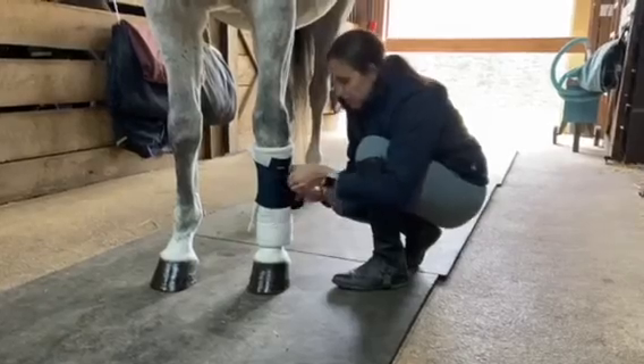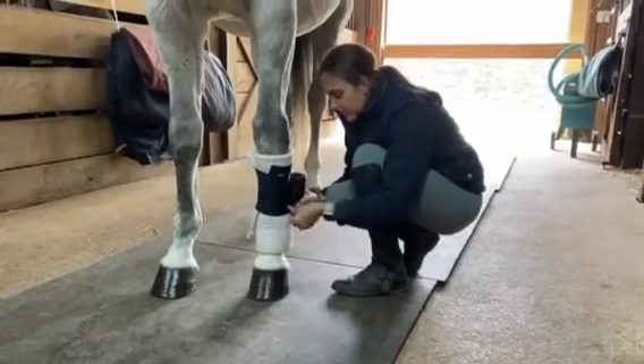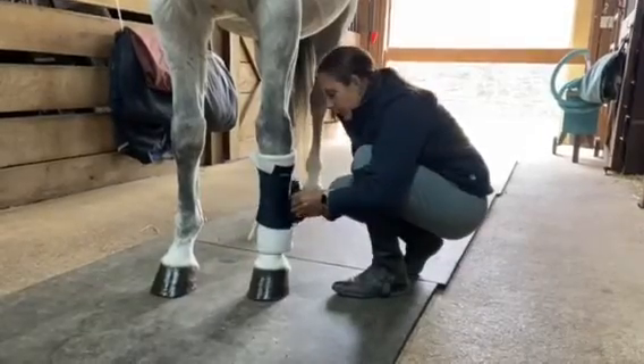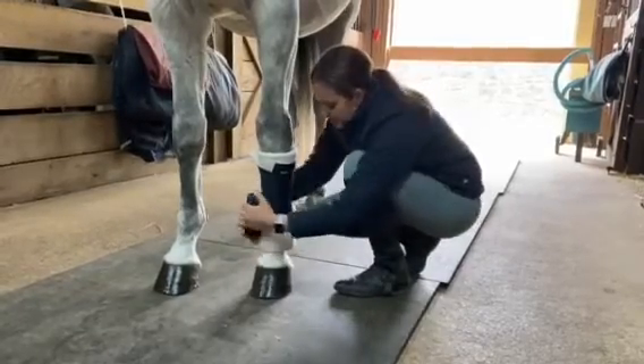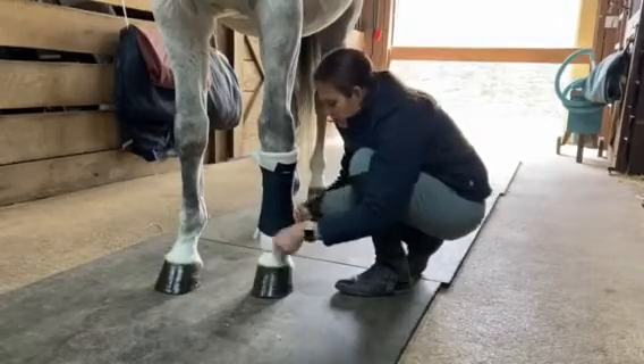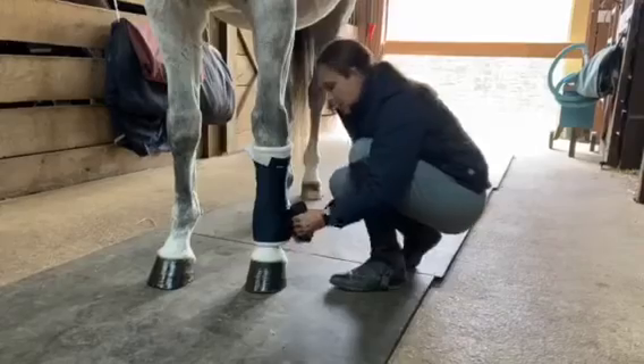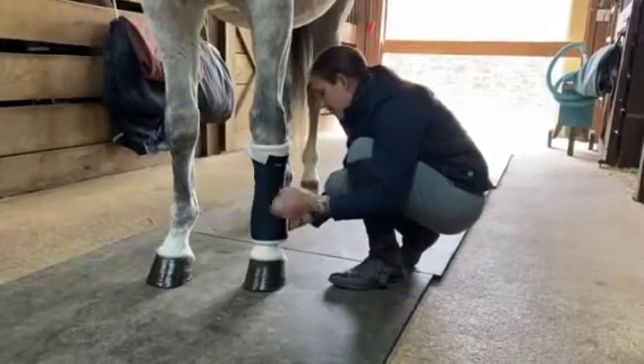You want to make sure that there are no wrinkles in your bandage. If there are any wrinkles, just pull them out and smooth them with your hands, working your way with even pressure down the leg. As you get to the bottom of your pillow wrap, just leave a little bit of white showing so that you have even pressure throughout the entire bandage.